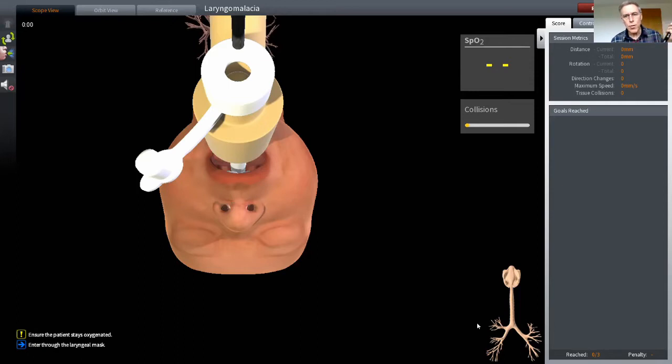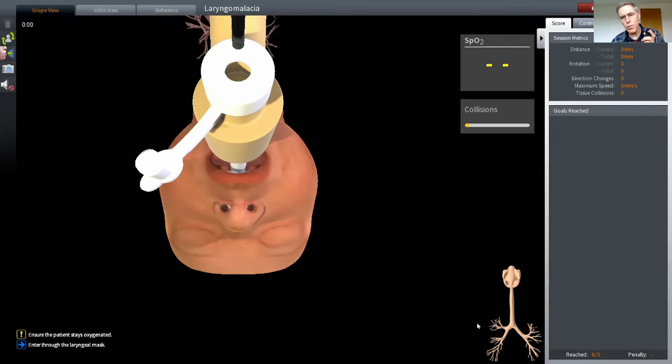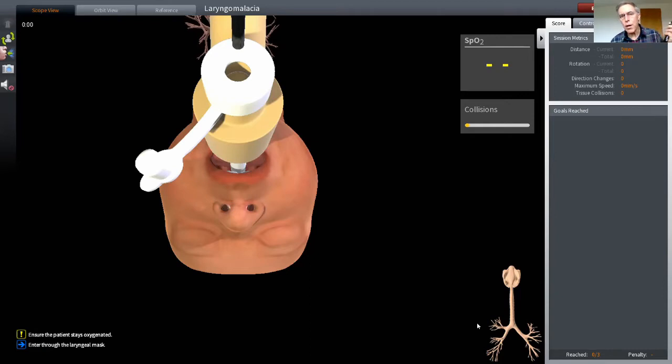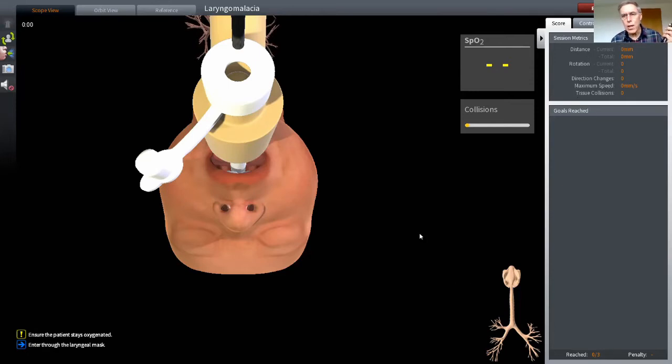We also record collisions as an indicator of accuracy of movements through the airway, and there's a number of metrics that you'll see starting to move as soon as we go within the airway. They're up on the right-hand corner. They record distance, rotation, direction changes, speed, and tissue collisions.